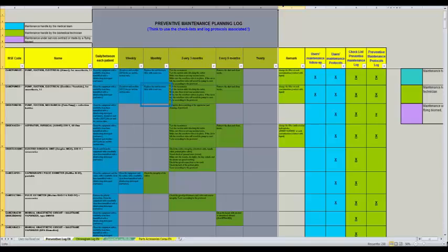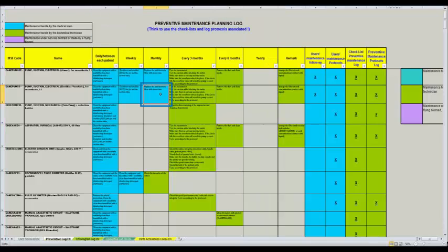If you read the box E9, "replace the antibacterial filter with a new one", you should understand this task is related to the electrical suction pump device manufactured by Vilbis. It must be done each month. It must be organized and performed by the medical team because the box is in blue.